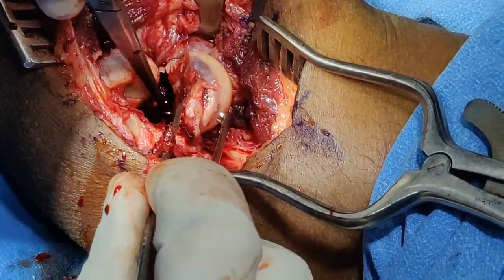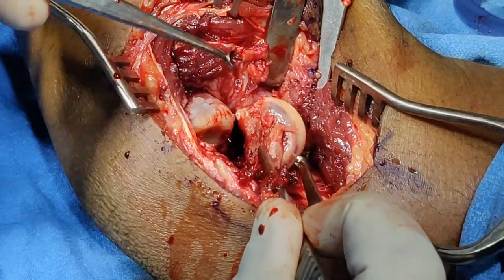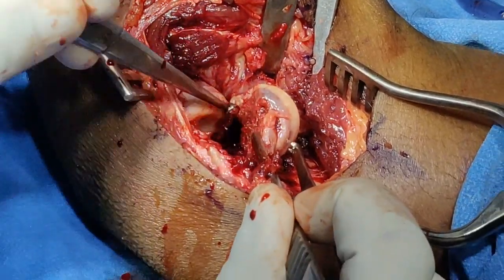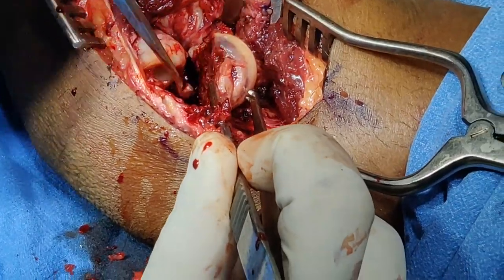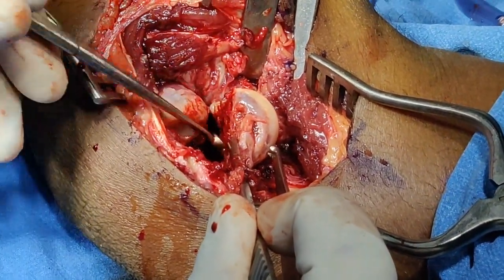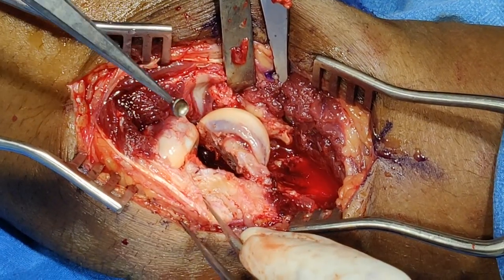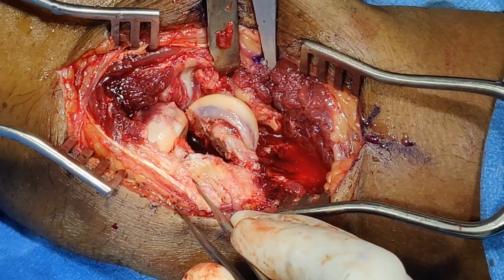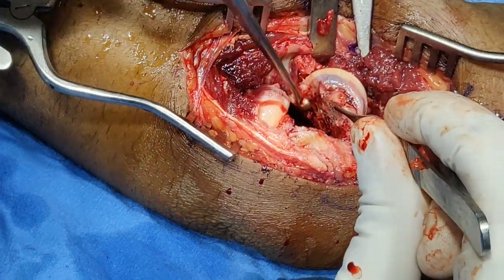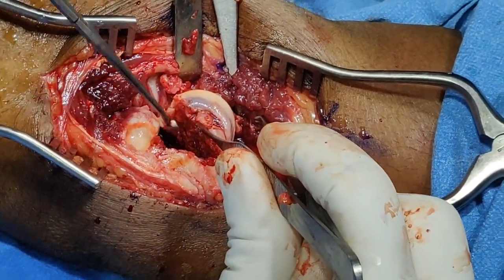I have scraped out the anterior surface of the humerus and you can see it is all smoothed out. I am freshening it up with a curette until the membrane that formed over these 15 days is gone. Old fractures like this are uncommon in developed countries but not unusual in the developing world. It is extremely important that you freshen up both fracture edges before you attempt any reduction.